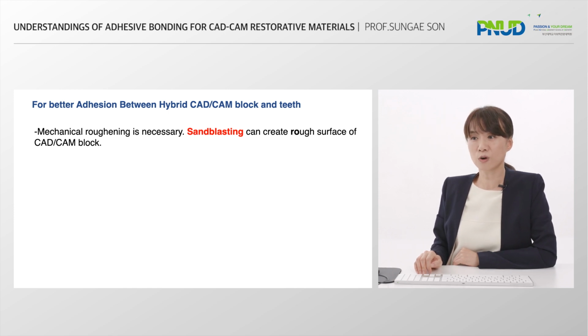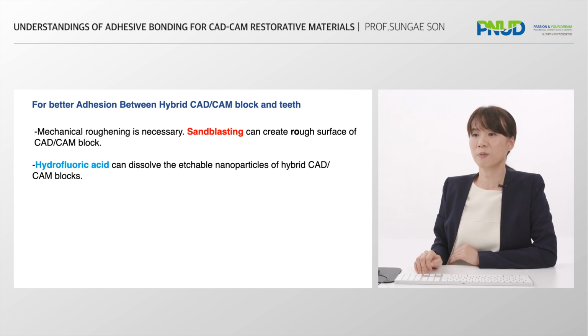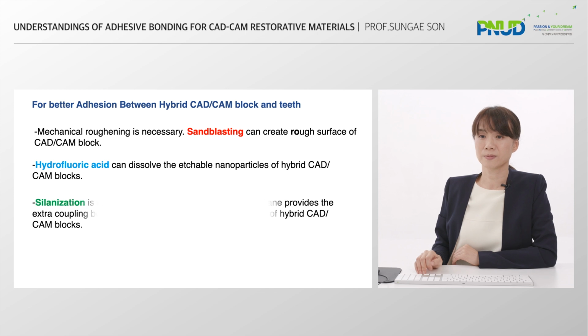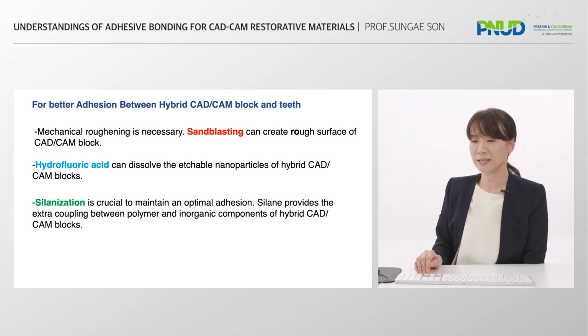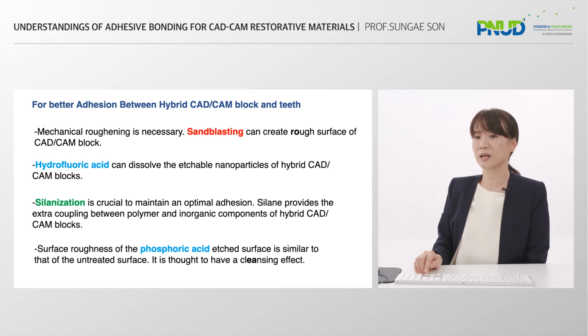Sandblasting can create a rough surface of the CAD-CAM block. Second, hydrofluoric acid can dissolve the etchable nanoparticles of hybrid CAD-CAM blocks. Third, silanization is crucial to maintain optimal adhesion, and the surface roughening of the phosphoric acid etched surface is similar to that of the untreated surface.